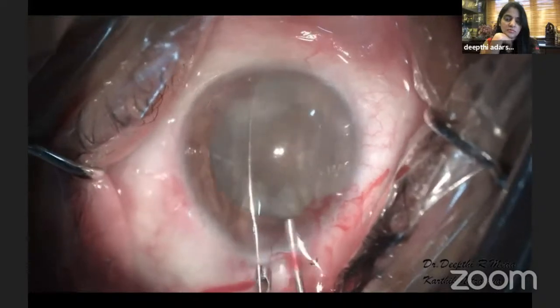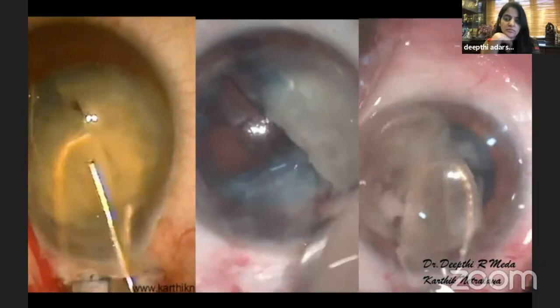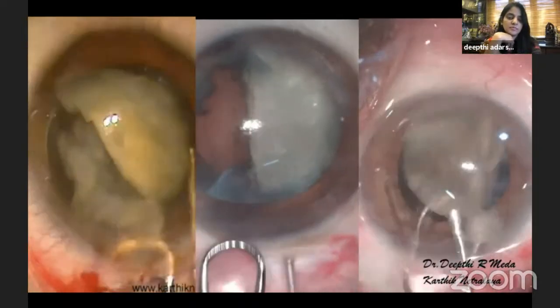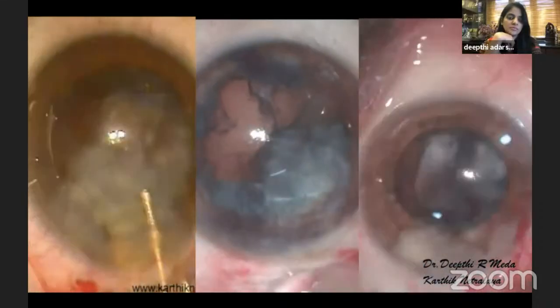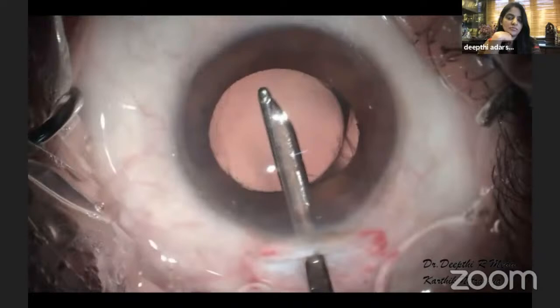A cannula, again, which is continuously injecting visco, is used to feed the nucleus into the snare. So these bisected or trisected nuclei can be easily extracted through the 6 or sub 6 mm incision, again using a wire vectis and a cannula that is continuously injecting viscoelastic. A quick cortical cleanup and IOL insertion completes the surgery.